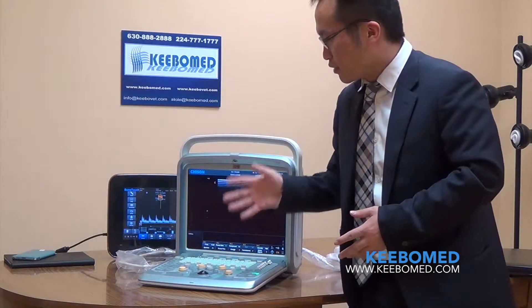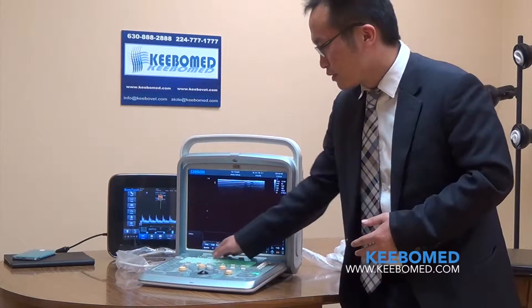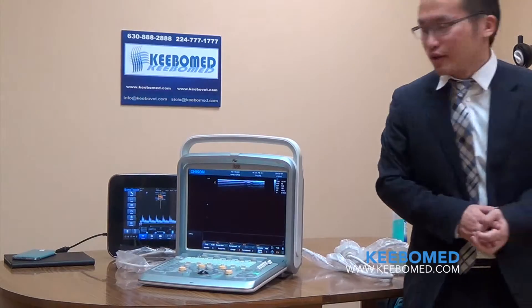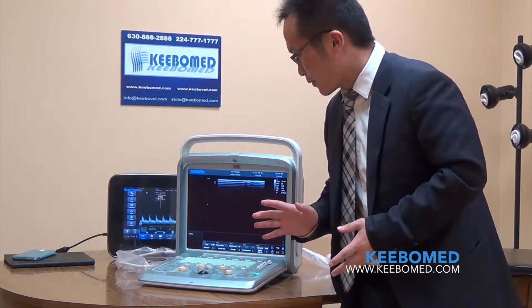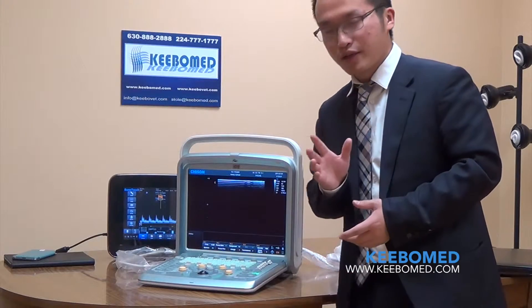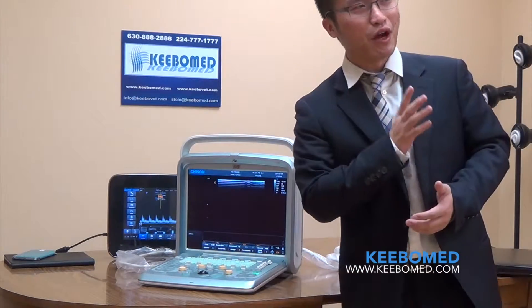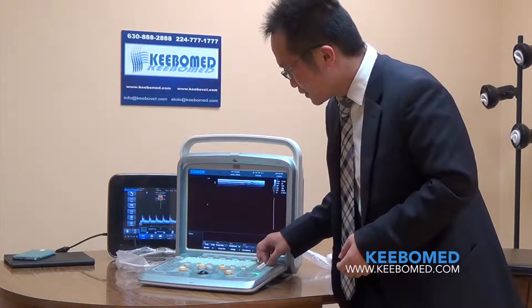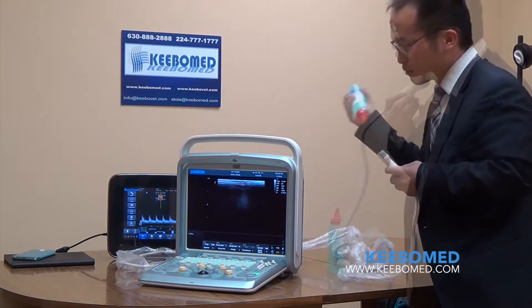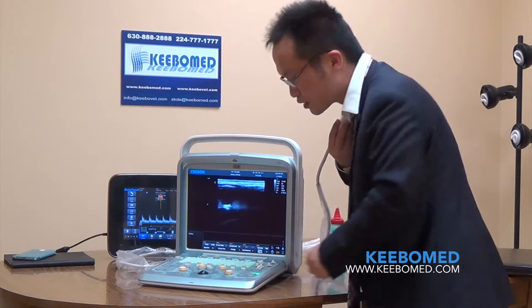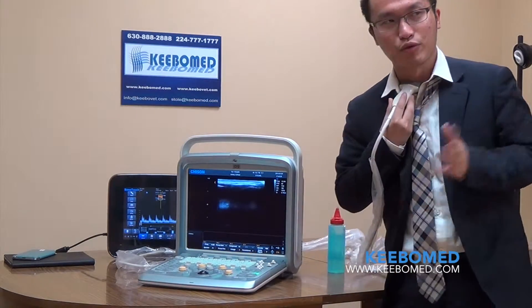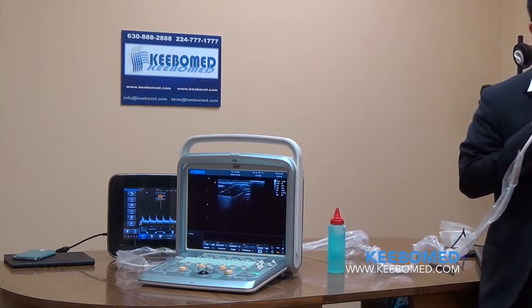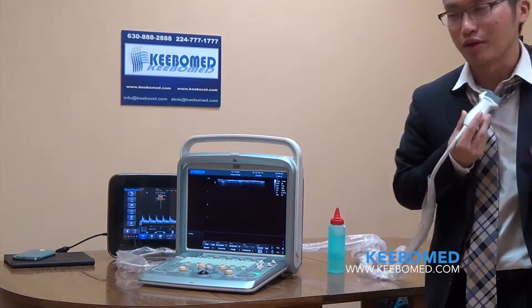For both Q5 and Q9, our system is very easy to adjust — touch it to adjust the fourth line, rotate it to adjust the second line. We also have a function on the Q5 called One Key, or AIO — Automatic Image Optimization. Sometimes the image looks strange and you don't know how to adjust it. Just press one key and you get a good image. One key optimizes the image automatically — that is what AIO means.